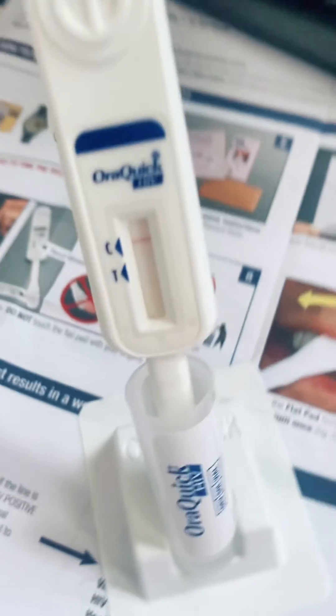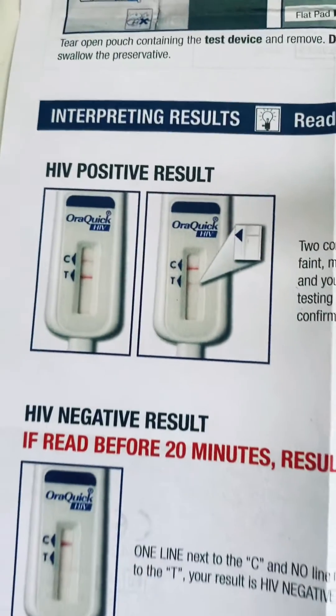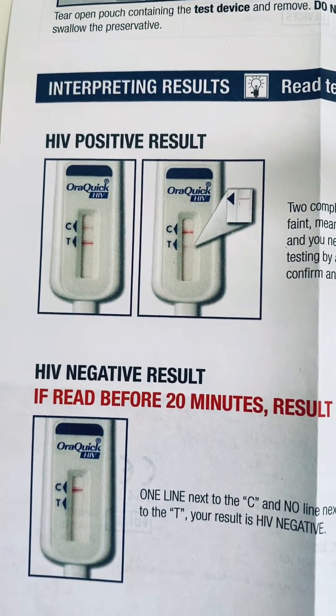After 20 minutes, mine was negative. One stripe would show a negative result; two stripes would show a possible positive.